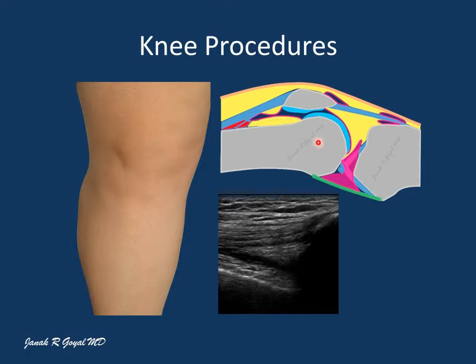This drawing of the sagittal section of the knee through the intercondylar fossa shows structures which are commonly seen on the sonographic examination of the knee. In the suprapatellar region, from superficial to deep, the structures encountered are skin, subcutaneous tissue, quadriceps tendon, suprapatellar fat pad, base of the patella, and a suprapatellar recess, prefemoral fat pad, and the cortical surface of the femur.